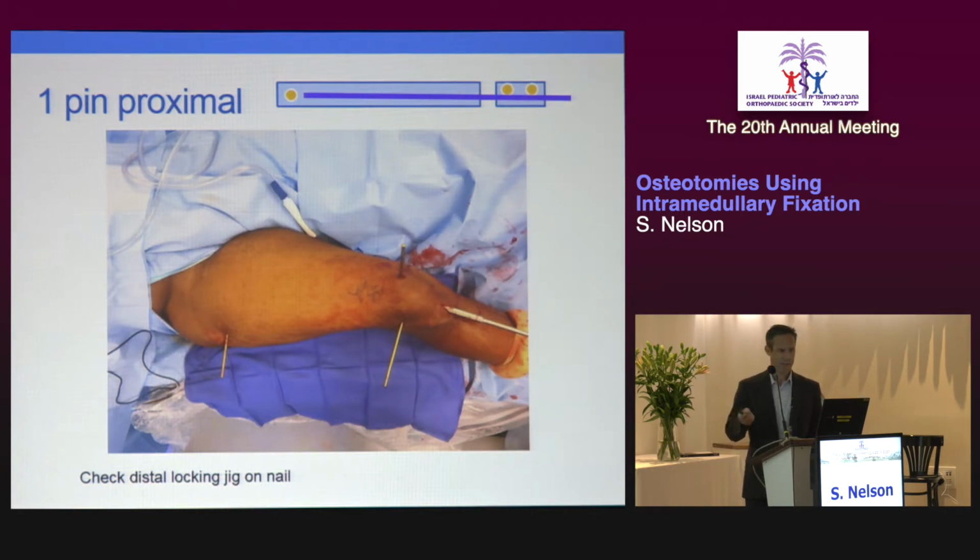It's only necessary to place one pin proximally, and I usually place that clear up in the metaphyseal area outside of the area where my nail will be going in order to have plenty of space and not have any interference from that nail.